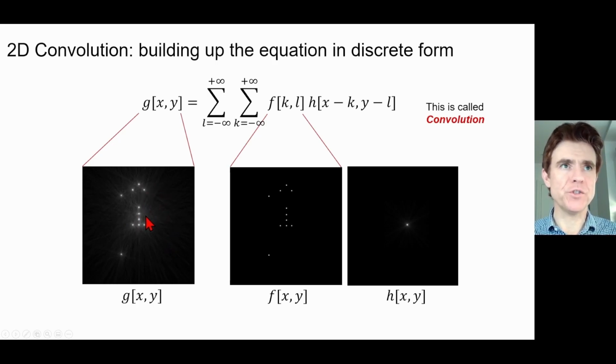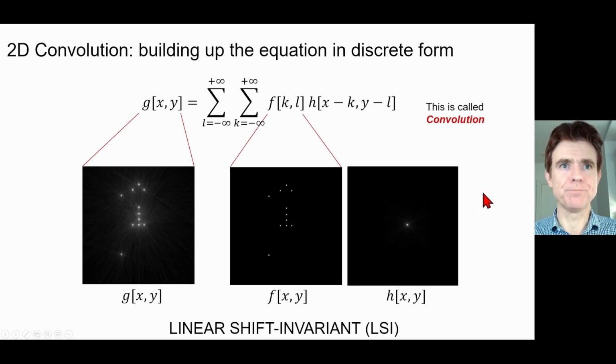Now here this is noise limited, and so it's not a pure convolution. If I'd simulated infinitely many events here, then that would be a very smoothly varying function, and you wouldn't see those discrete tails there. But you get the idea. It's just a simple substitution. A point object gets replaced by a point spread function.